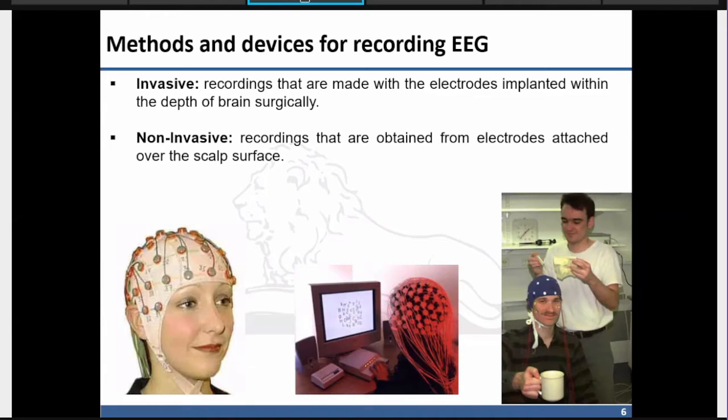So if you go for one electrode, two electrodes, then the cost is in terms of 5,000, 10,000 INR, Indian currency. But if you are going for 256, a very dense device, the cost will be higher. Okay, so that's how the range is.